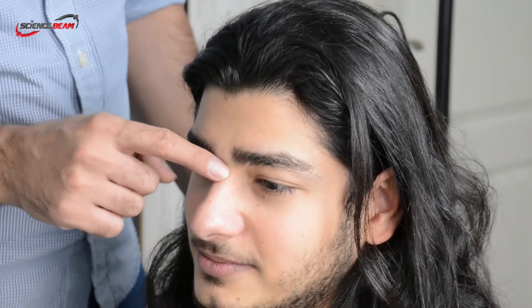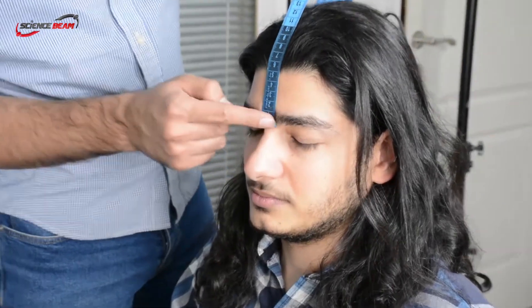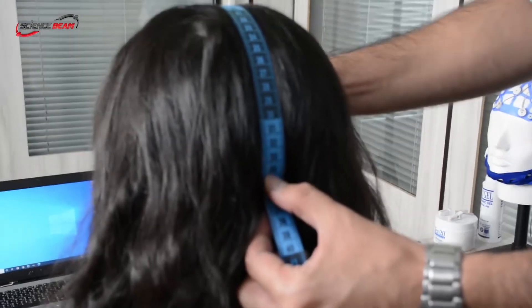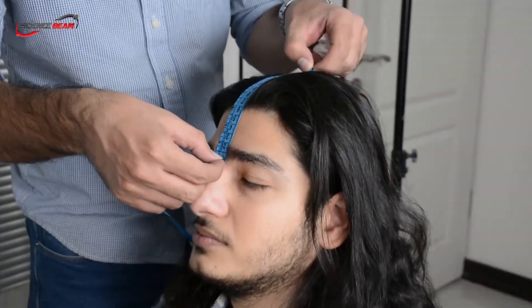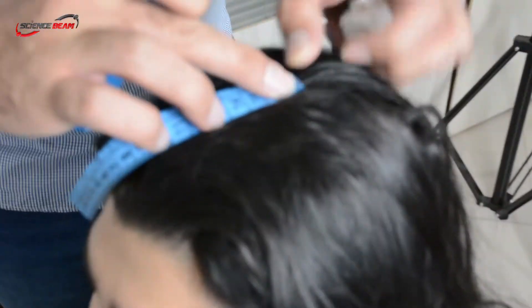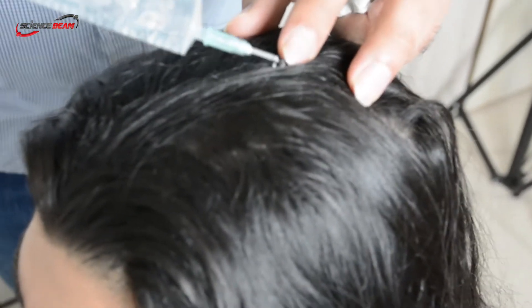First you have to find the CZ point of the client's head. To do so, measure the distance between the inion and nasion points and divide the distance by two. Mark the CZ point and put the cap on the client's head by placing the CZ electrode on the marked point.